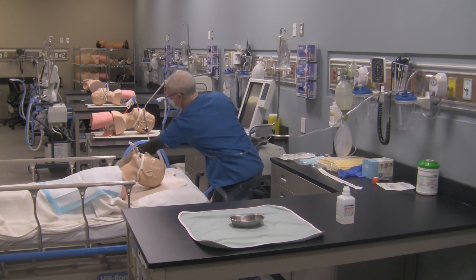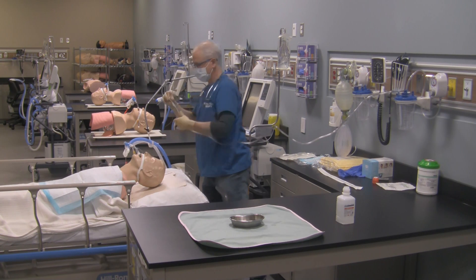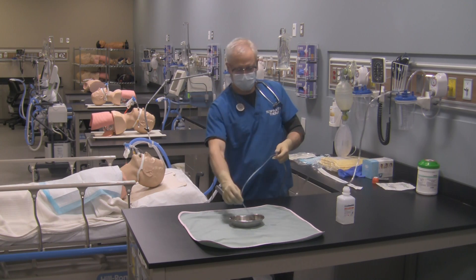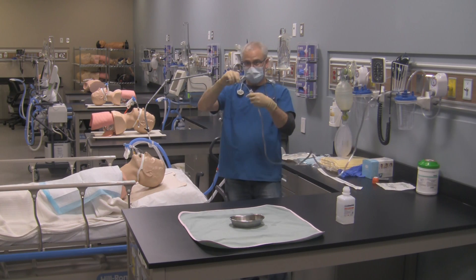Once you've done that and got all the secretions out, loop your tubing so you don't compromise your sterility. Grab the ventilator circuit and place the appropriate connector back on the endotracheal tube. Go back over here and clean out your suction catheter and suction tubing. Loop it again.